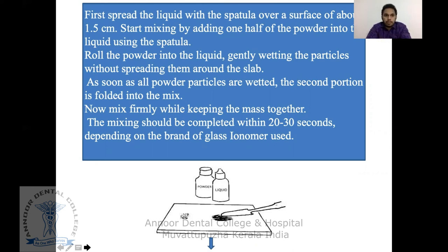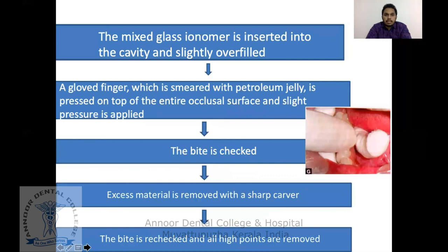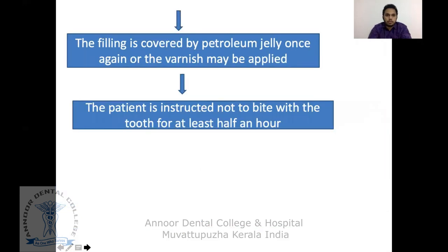Start mixing by adding one half of the powder into the liquid using the spatula. Roll the powder into the liquid gently, wetting the particles without spreading them across the slab. Once all powder particles are wetted, fold in the second portion and mix firmly. Mixing should be completed within 20 to 30 seconds depending on the brand of glass ionomer used. The mixed glass ionomer is then inserted into the cavity, and a gloved finger smeared with petroleum jelly is pressed on top with slight pressure applied. The bite is checked, excess material is removed with a sharp carver, the bite is rechecked, and the filling is covered with petroleum jelly or varnish.